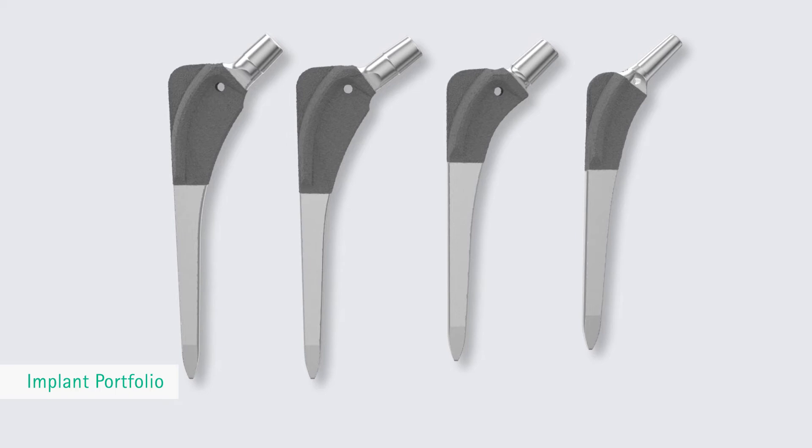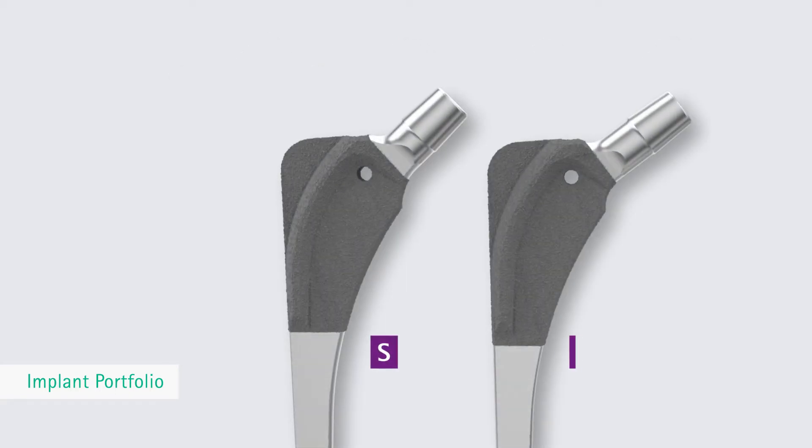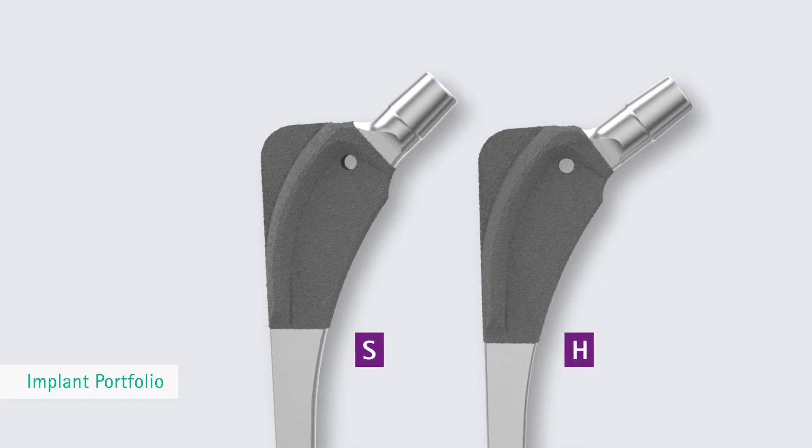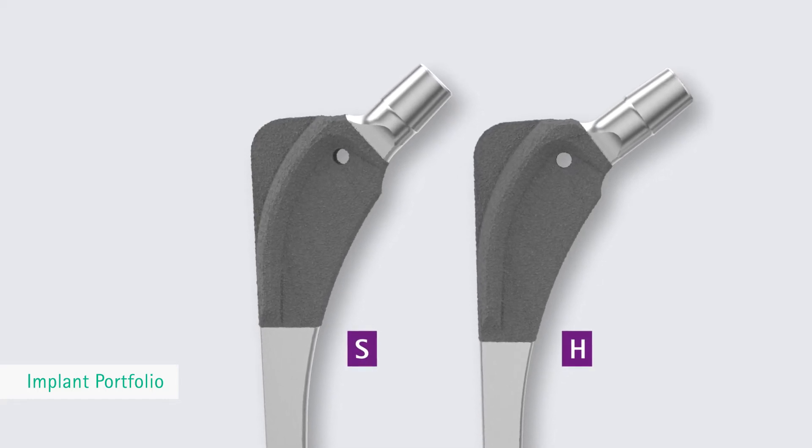These morphologies include normal, dysplastic, and very tight conditions in the marrow cavity. For normal medullary canal conditions, the Bicontact stem design offers the standard stem type S, or type H for high offset.